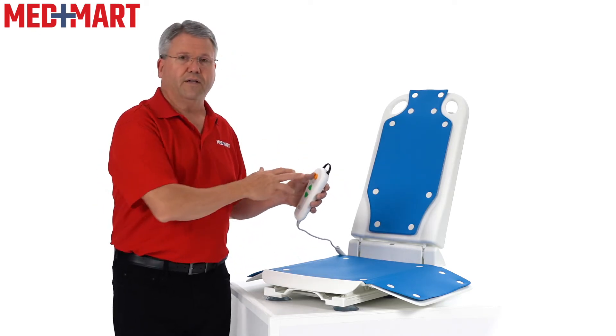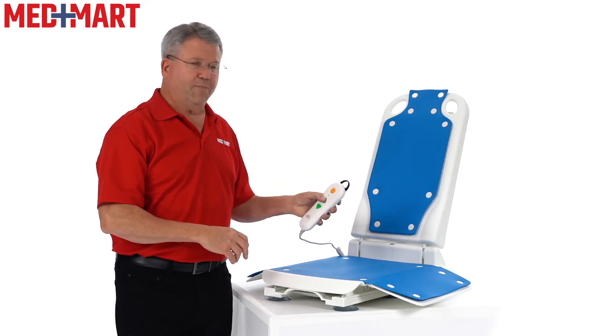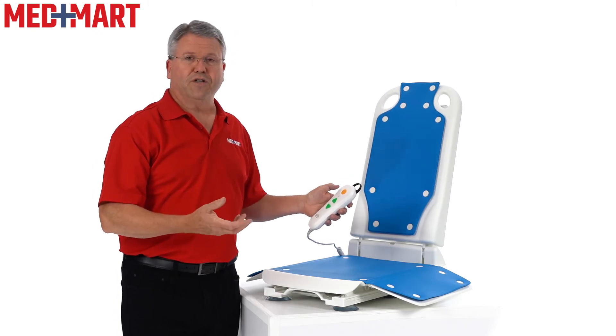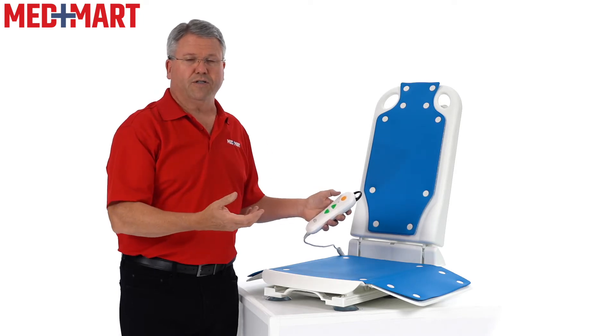The only time you'd hit the yellow button at the top is for the emergency stop. Below that is an LED indicator — when I press the button it illuminates green, which tells me it's good to go. If your battery is starting to get low, it will turn amber, and that's the time you want to charge it.